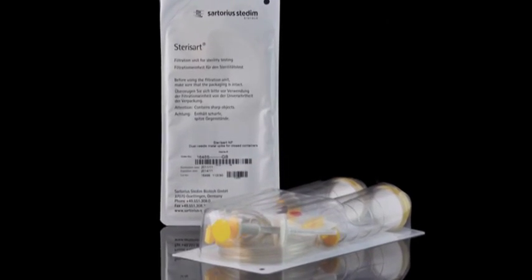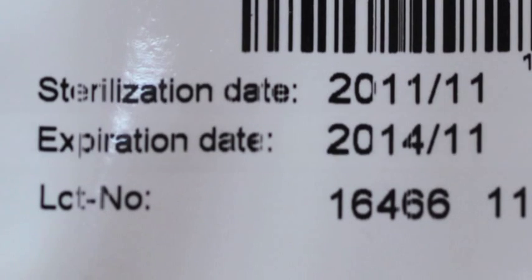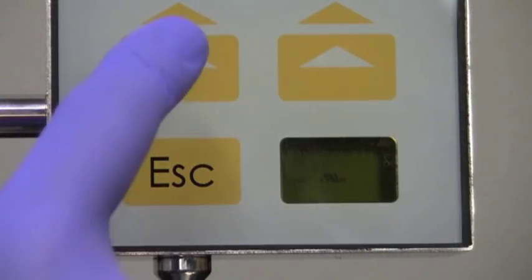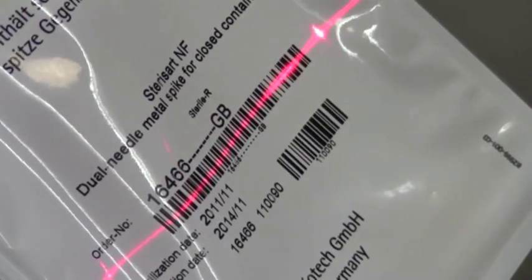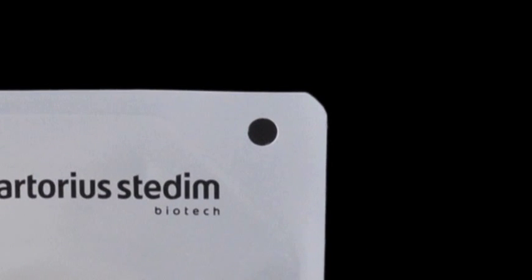Sterisart canisters come individually wrapped in a blister pack. On the back you will find the product number, sterilization date, expiration date, and lot number. All are barcoded for use with Sterisart's built-in barcode reader. There is a convenient hanging notch on the package for use in an isolator.